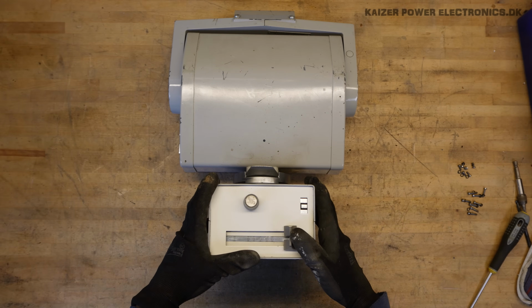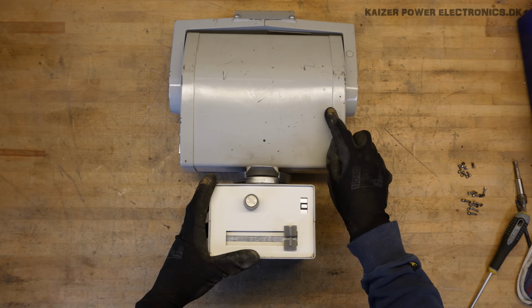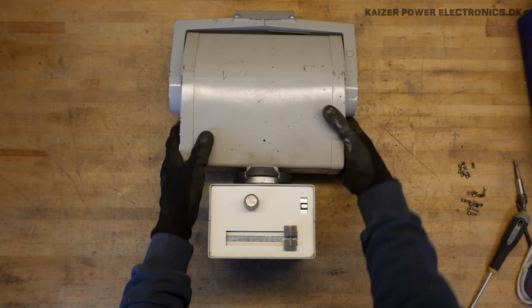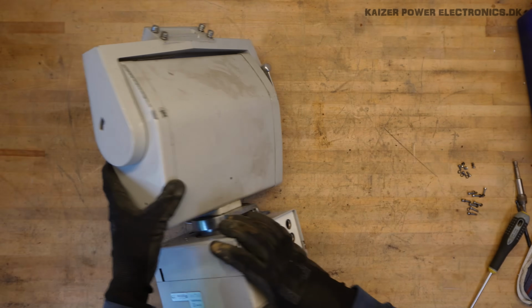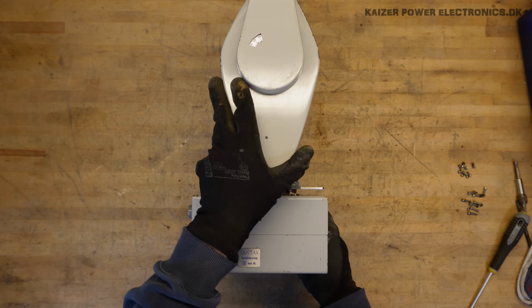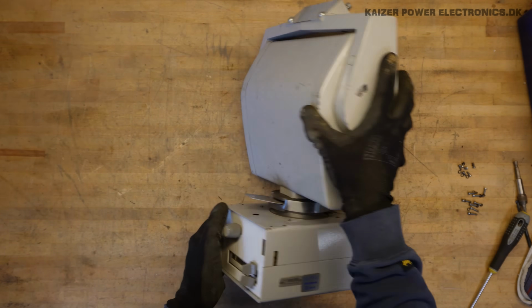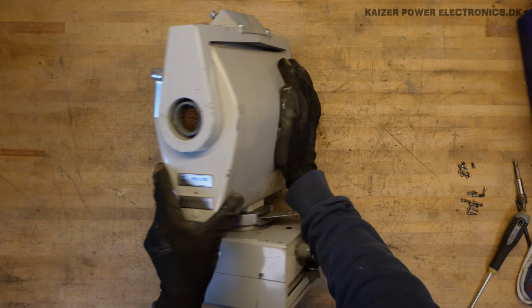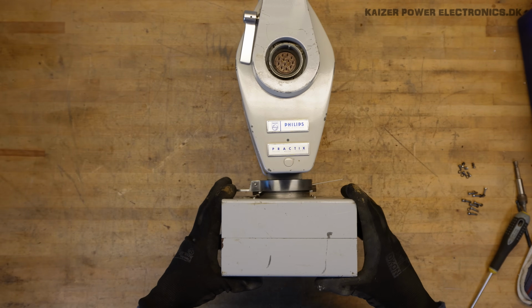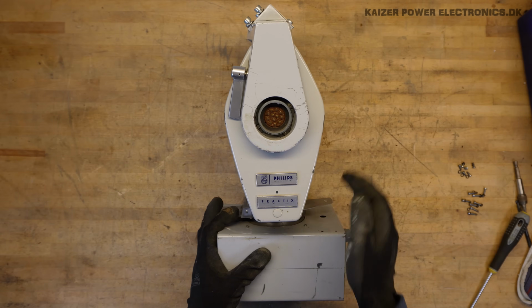Now the X-ray head is leaking oil from this part. This is at least where it was wet, and this has been dripping out over a few years that it has been in my storage. So I think we can safely assume that it is no longer optimally filled with oil as it should be. And as I said in the start of the video, I have no intention of actually producing X-rays. That is just not part of my definition of a safe hobby. Despite having torn down X-ray heads before, and that is quite messy, I think we should try it anyways.